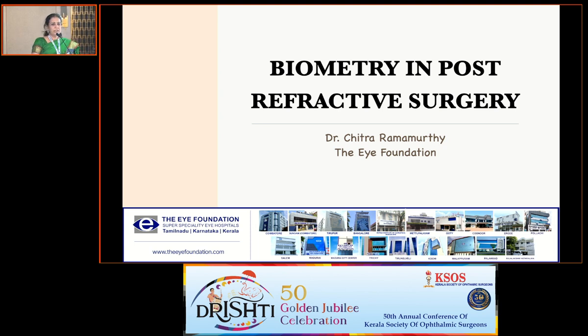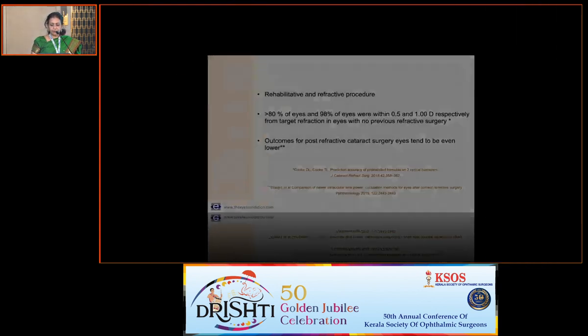So biometry is actually a complex topic, and post-refractive surgery makes it a little more complex, because the challenge here is that these patients have enjoyed that visual independence before when they got the refractive procedure, and would want similar, and would even be ready for enhancements if they are stuck somewhere.